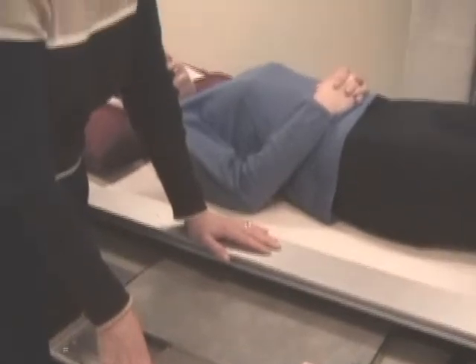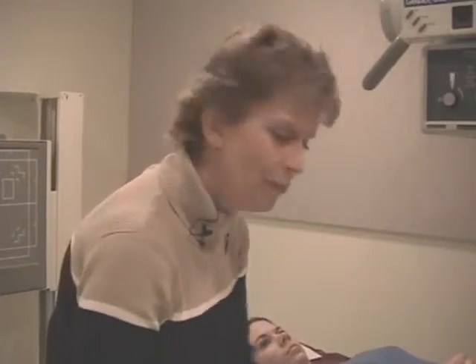Other departments will keep the collimation to just the edge of the film because they're doing survey work. They want to get the entire body, and collimate just within the rib cage. So you need to inquire into the philosophy of your department, know why they're taking the x-rays, and that can help you make some of your decisions. The tighter the collimation, the better it is for the patient, the increased contrast, less dose for the patient. However, back pain might be kidney pain, so some places do survey work, and they do not collimate down as tightly. Okay, we're going to talk to our patient now.